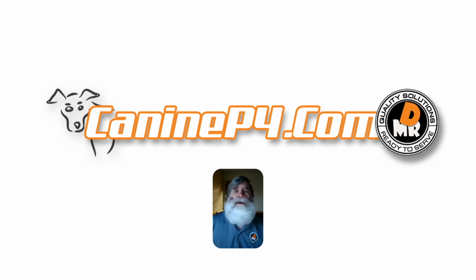The testing is done one after the other, so there are no time delays. That's really what reproducibility and precision will be. So we'll use the terms interchangeably, and let's go on to the video and we'll show you what we mean.